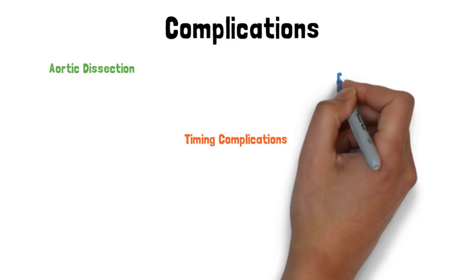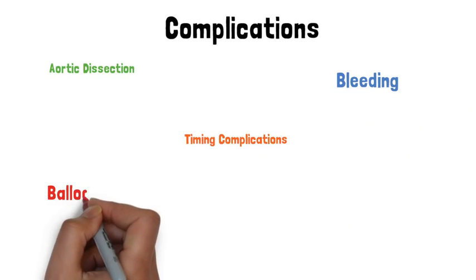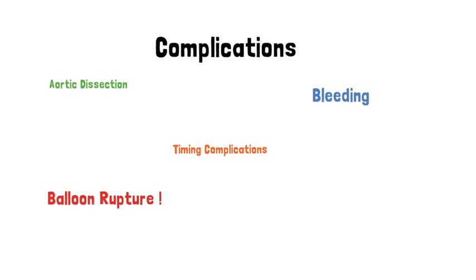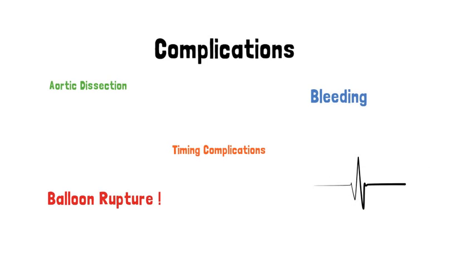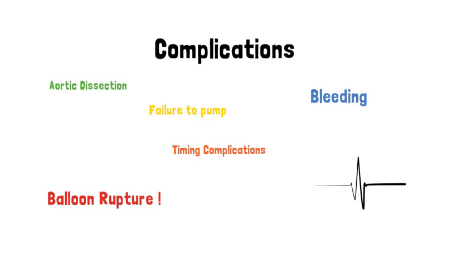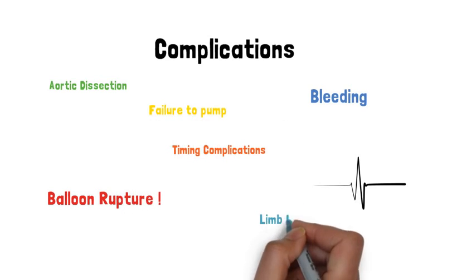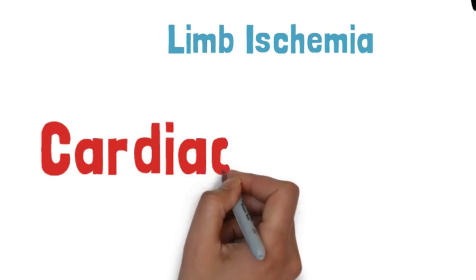deflation as well. Some other complications include bleeding at the insertion site. You can have a balloon rupture. There can be dysrhythmias that are associated with counterpulsation. Failure of the pump, limb ischemia can happen as well from positioning issues, and also cardiac arrest.